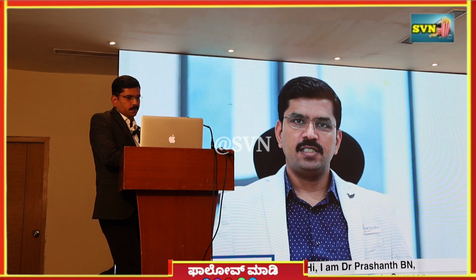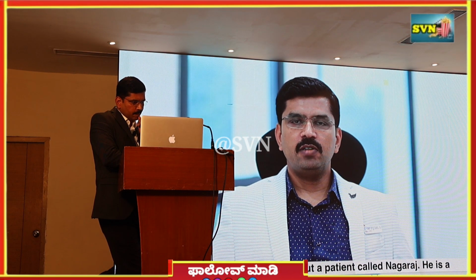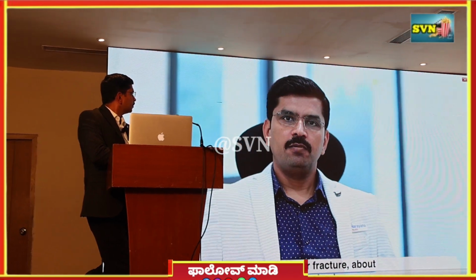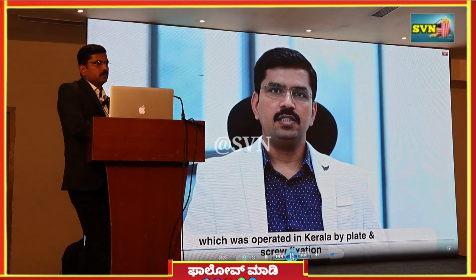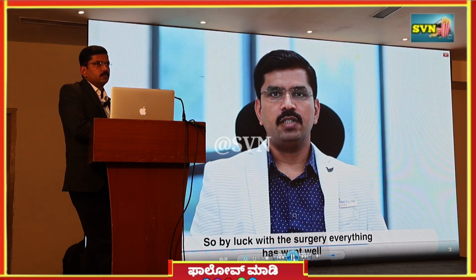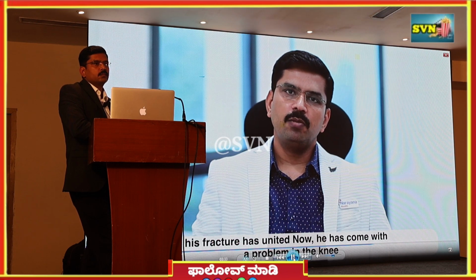Hi, I am Dr. Prashant, robotic arthroplasty surgeon from Narayana Health, Bommasandra. So today we will discuss a patient by the name Nagaraj. He is a gentleman of 65 years. He had a femur fracture around 7 years back, which was operated on somewhere in Kerala with plate and screw fixation. Luckily with the surgery, everything went well. His fracture has united. Now he has come with a problem in the knee.